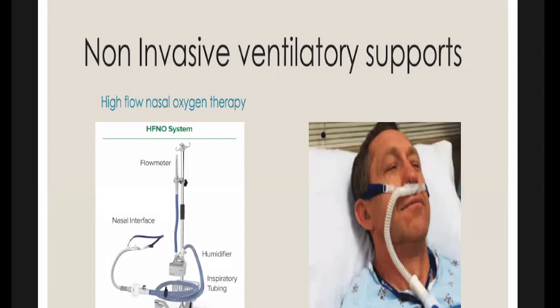All right. And yes, madam, the humidifier. You have to always check if the humidifying is going on. If it is not there, there's a risk of drying the nasal passage, because it's a very high flow rate and it can dry out the nasal passage. In susceptible patients, they can even bleed from the nasal mucosa because it is very fragile. Okay, right. So those are the problems associated with the high flow nasal oxygen.